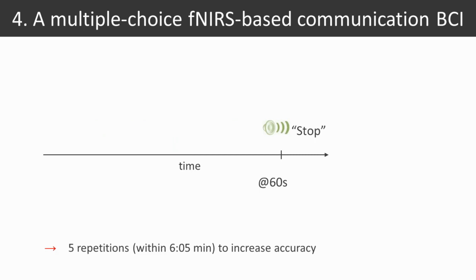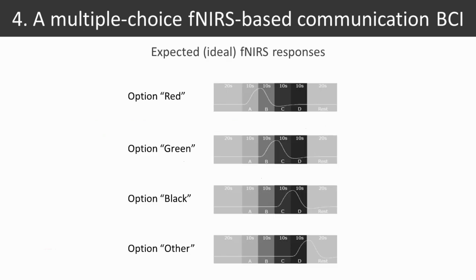Okay, so in our experiment, we included 5 repetitions. That means 5 times the answer was encoded, and this was based on previous research. We started with a more conservative approach because we were not sure about how good the answer encoding accuracy would be, to have more flexibility later for an analysis. So here you see the expected ideal fNIRS responses. Depending on whether a subject starts early or late, you see a shift of the hemodynamic delay, or the hemodynamic response here in this case.